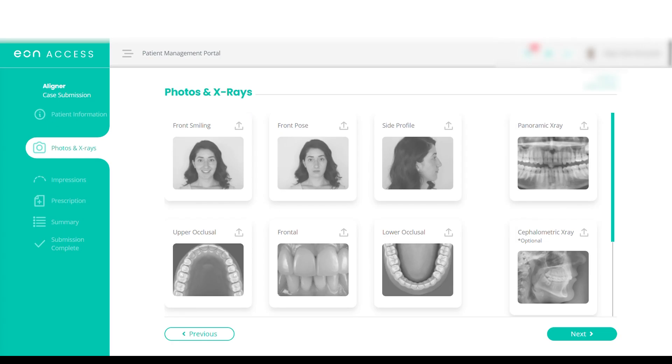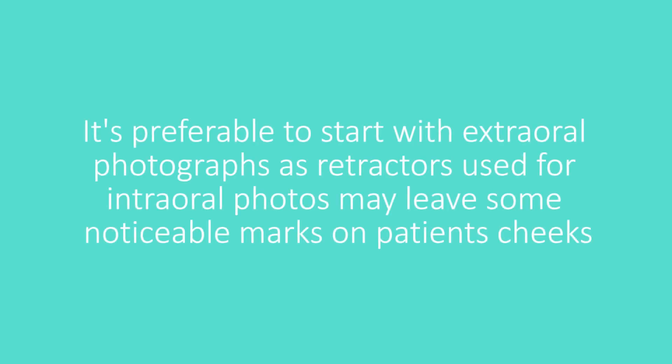EON requires eight clinical photographs: three extraoral and five intraoral. It's preferable to start with extraoral photographs, as retractors used for intraoral photos may leave some noticeable marks on patients' cheeks.